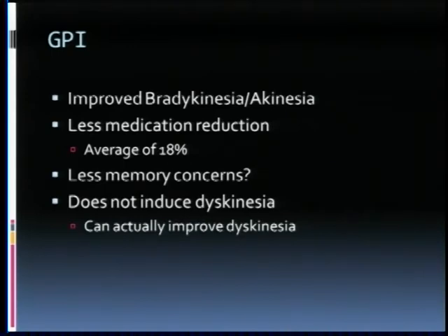However, the medicine reduction in the GPI is significantly less. This 18%, however, is positive because we used to think with GPI we really couldn't reduce medicine at all, and now they're finding, surprisingly but happily, that we can actually reduce medicine on average about 18% even with patients implanted in the GPI.